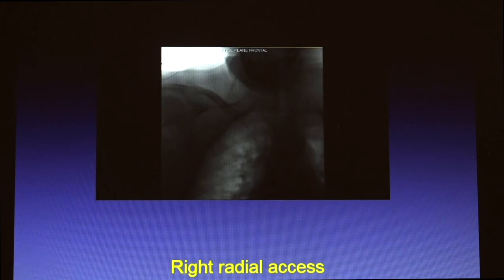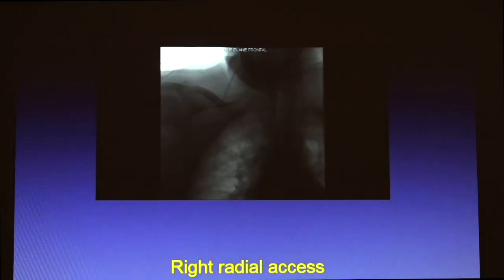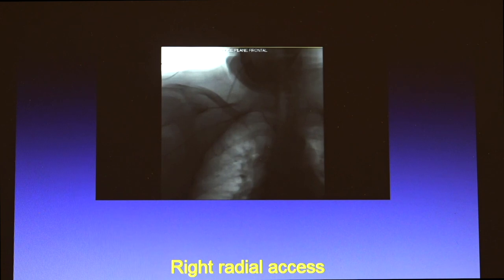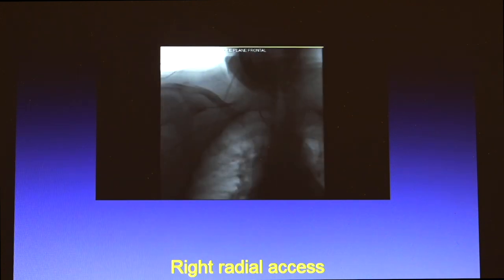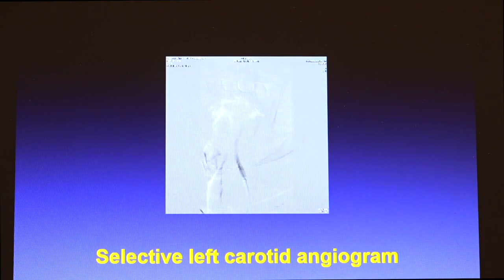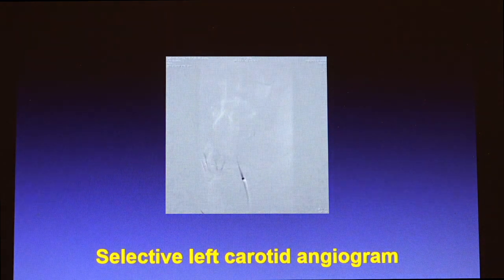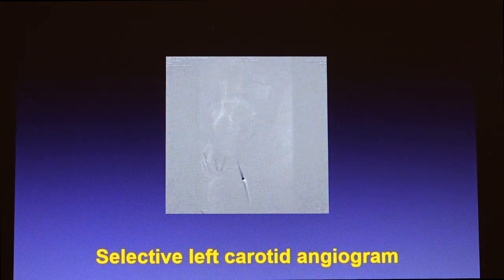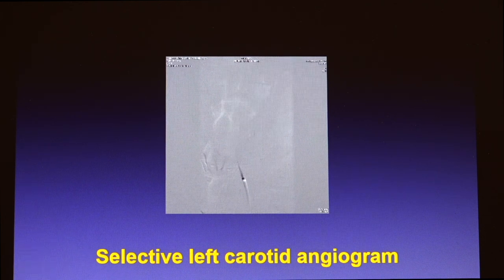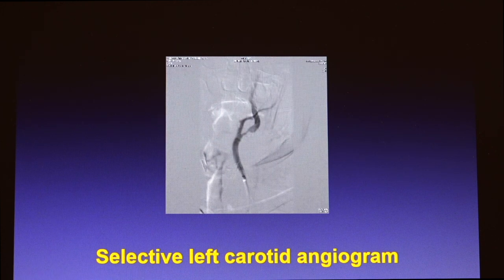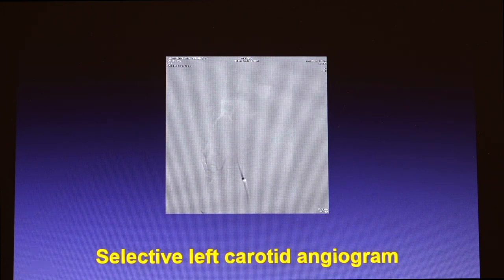So we switched to the radial artery. We immediately accessed the right radial artery and used the glide wire and glide catheter to go from the brachiocephalic trunk into the left common carotid artery. Over the wire, we were able to place the six-French sheath. We then did the selective angiogram, and you can see the lesion, which was pretty severe.